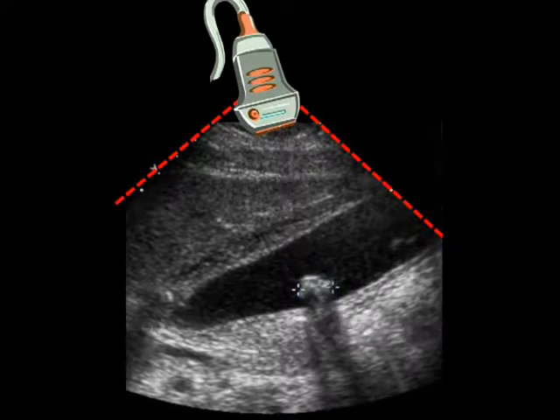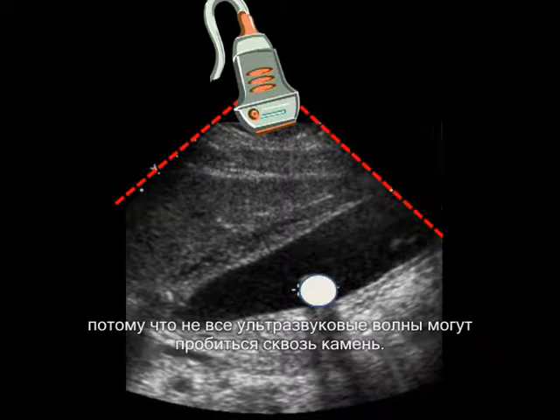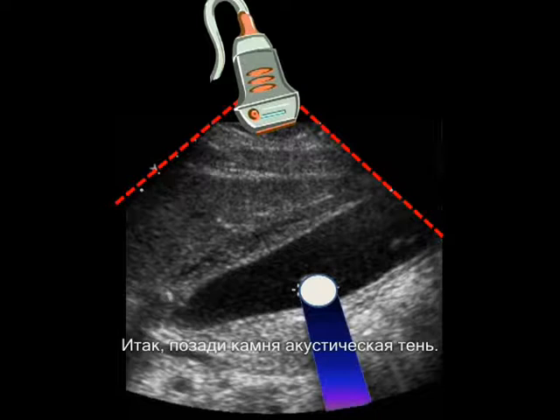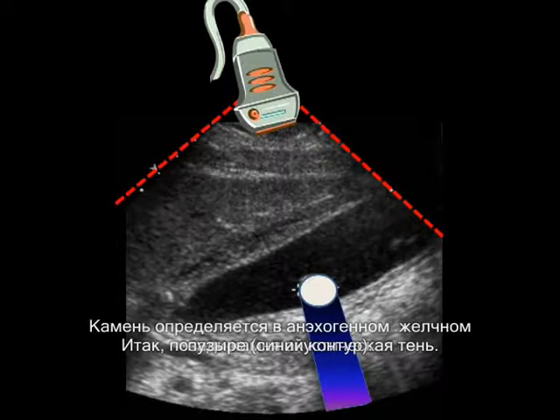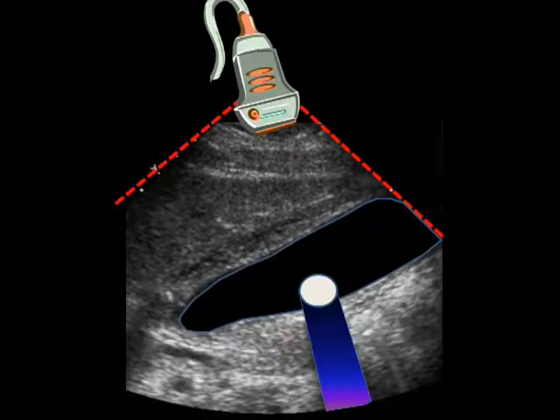The gallstone also creates an acoustic shadow, because none of the sound waves are able to penetrate and pass through the stone. So, distal to the stone, there is acoustic shadowing. And the gallstone is within the sonolucent, or echolucent, or anechoic gallbladder, which is fluid filled.